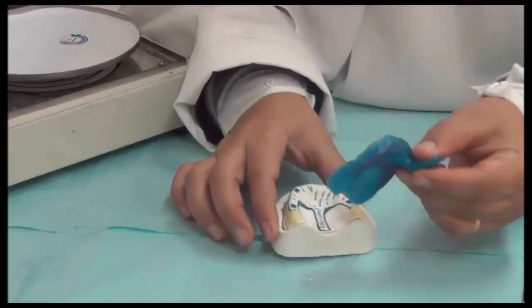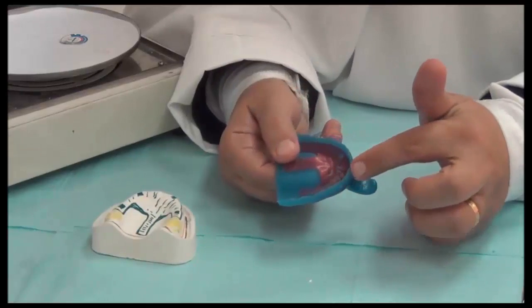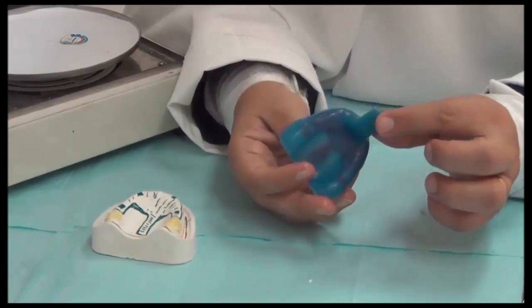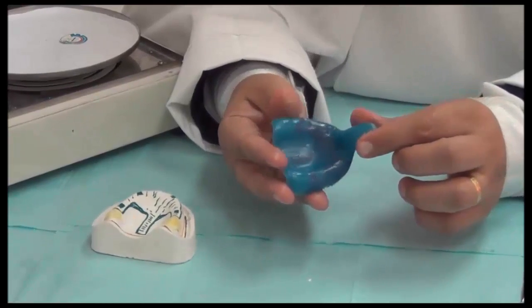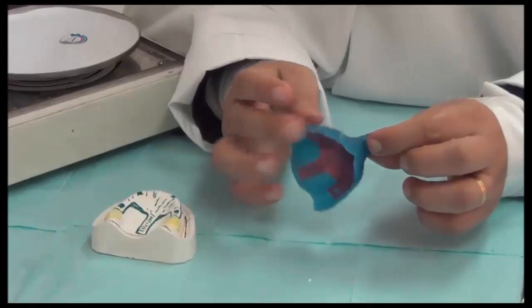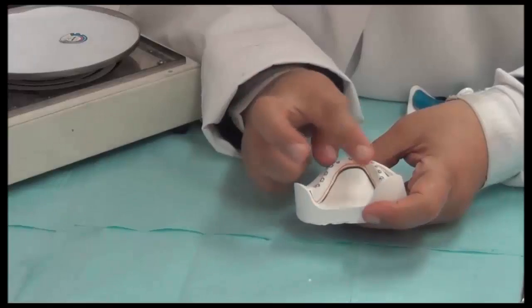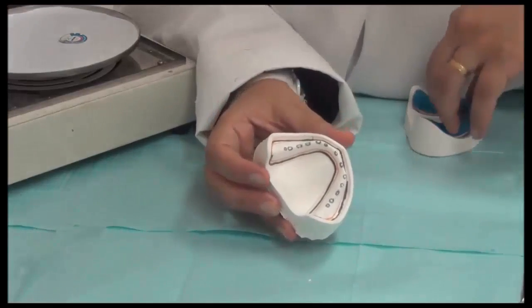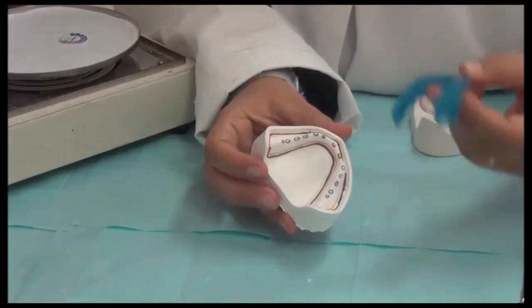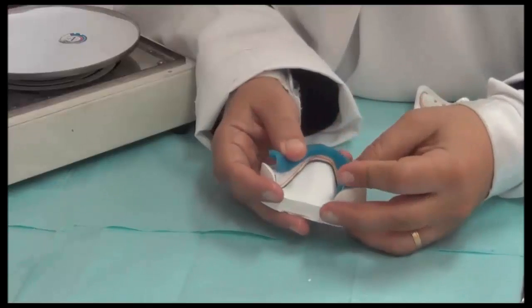Once we remove this, this is ready to be trimmed, smoothened, and then polished all together. So this is for the upper. We're going now to do the trimming step. For the lower, you have drawn the outline and then the outline of the tray. Then we're going to adapt the tray light cure material over the tray immediately and light cure it.